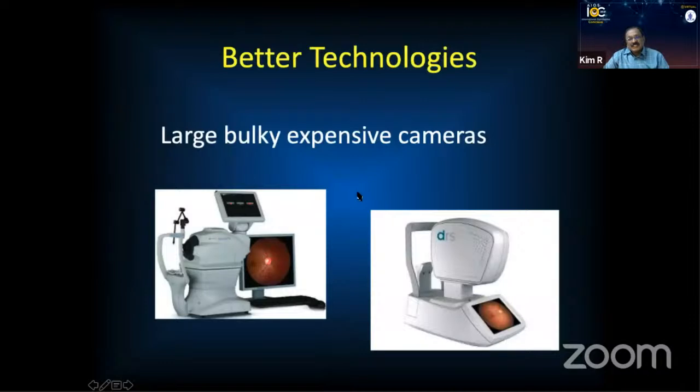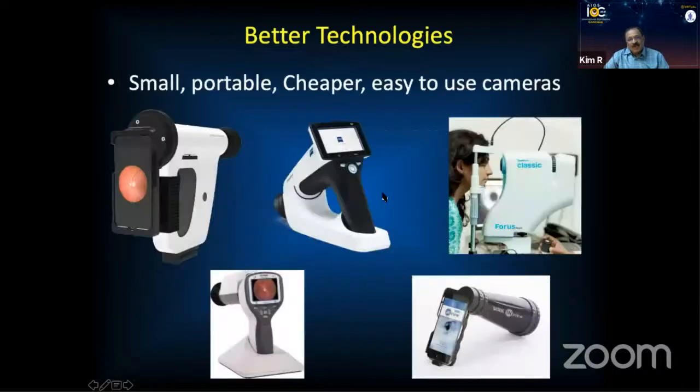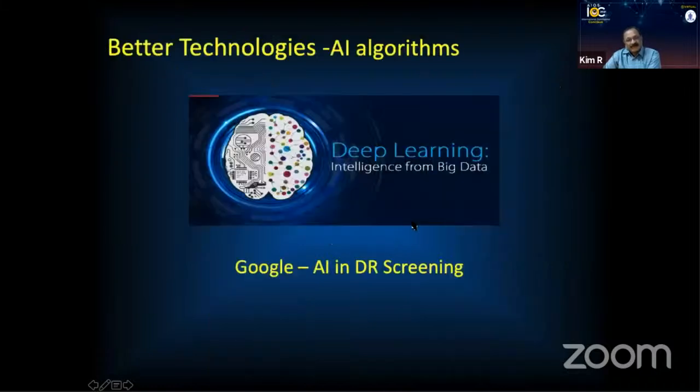Large, bulky, expensive cameras are being replaced with small, cheaper, easy to use cameras, which are much more easily portable, making it easy for us to take them to remote locations to screen patients anywhere.